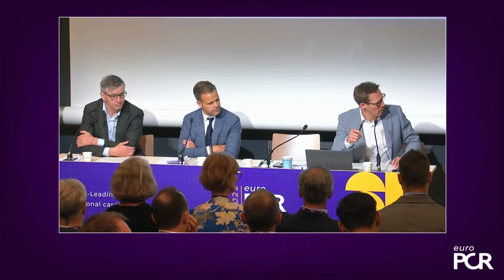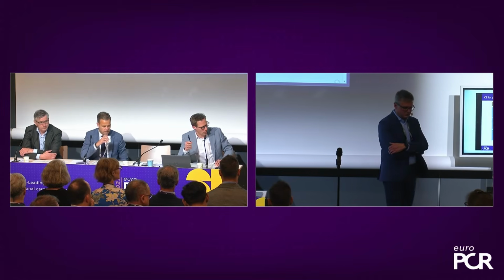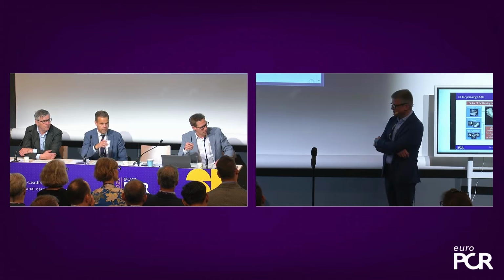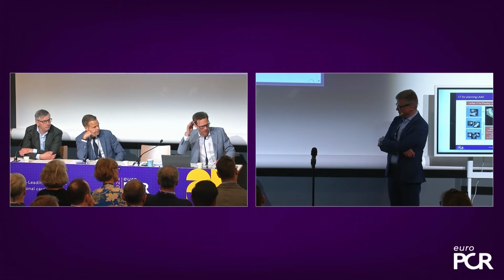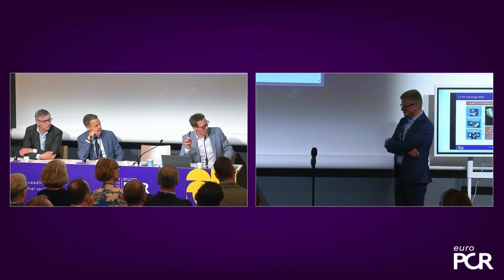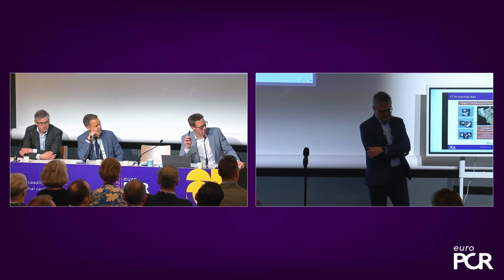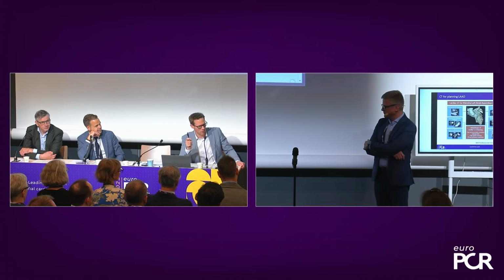Jens Erik, one more question for you specifically before we move forward. The thing that I struggled with when I moved to using ICE guidance was that, of course, we get superior and inferior from our ICE probe. We don't really get anterior, posterior, and you said it's quite crucial to have a posterior inferior puncture. Can you tell us how you assess anterior, posterior with a 2D ICE probe, which is what most people have?